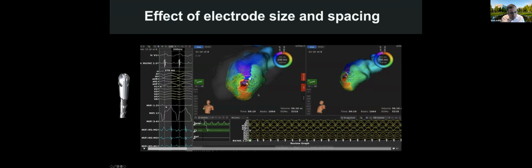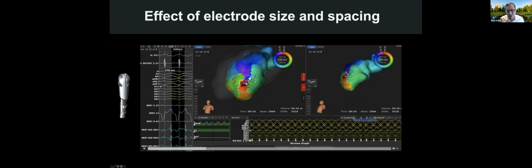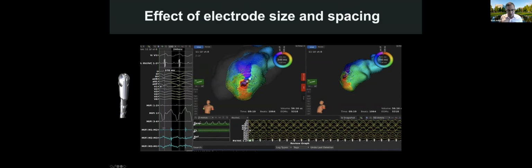So MiFi 1-2 is basically M1, M2. Okay, this is the M1, M2 that you see. The MiFi, those in blue, are the microelectrodes, and their gain is the same between them. So you can see how you can get those near-field signals in the isthmus that look like very low amplitude with the M1, M2. And I think that's the gestalt of why smaller electrodes, especially if both of them are touching the tissue, can give you more information than M1, M2.